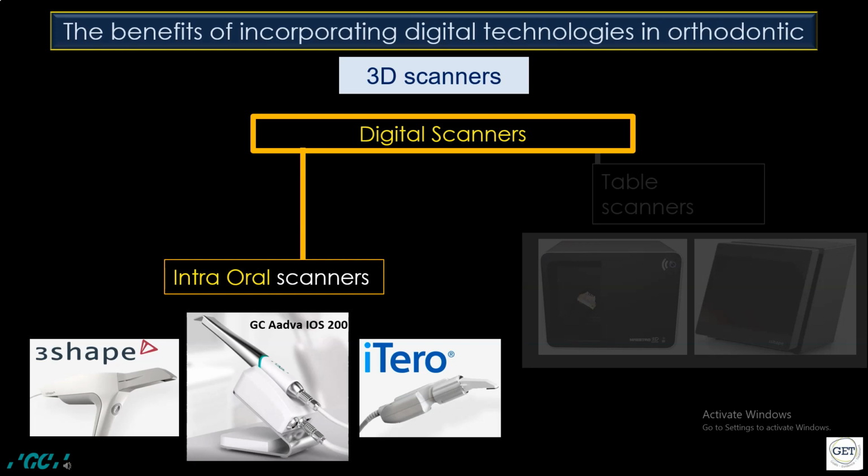A good intraoral scanner system depends on two components: the hardware, the handle and the cameras, and the processing software. The intraoral scanners had gone through important developments and today they can offer many advantages over the conventional impressions. Still, the cost of the intraoral scanner system is high and not affordable to every dental office and clinic.